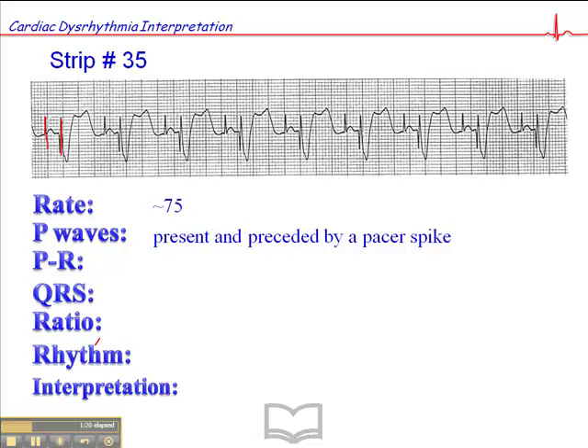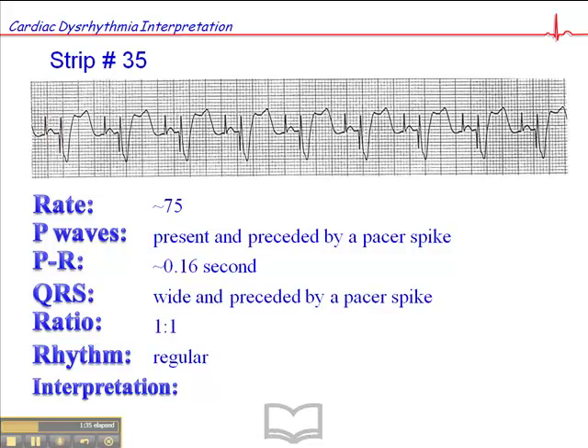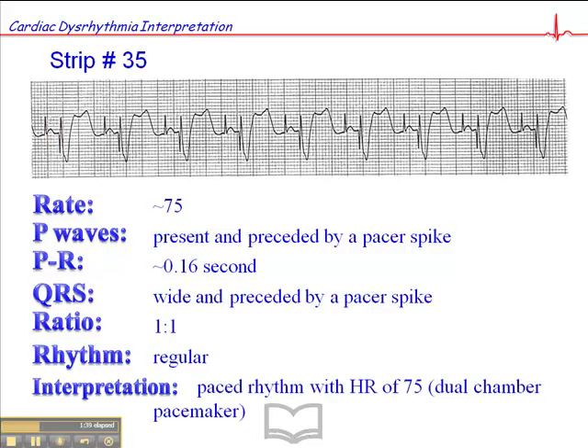The PR interval in this particular case is 0.16 seconds. The QRS is wide and preceded by a pacer spike. The ratio in this case is 1 to 1, the rhythm is regular, and the interpretation here is a paced rhythm with a heart rate of 75 — a dual chamber pacemaker. Patients usually know something about their pacemaker and should have information in their wallet about the type of pacemaker they have, whether it's a single chamber or dual chamber and how it functions, so it's important to ask the patient for that information.